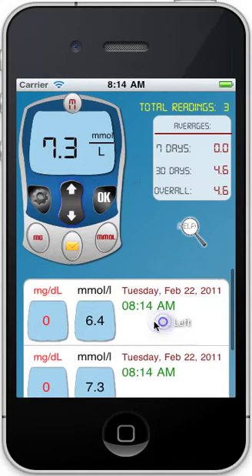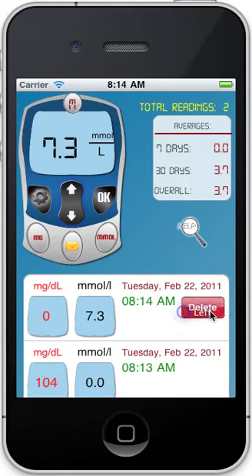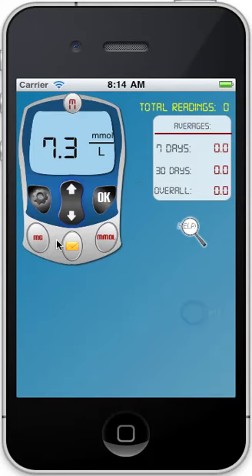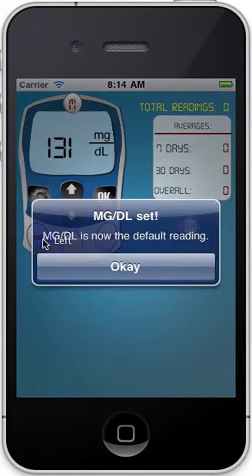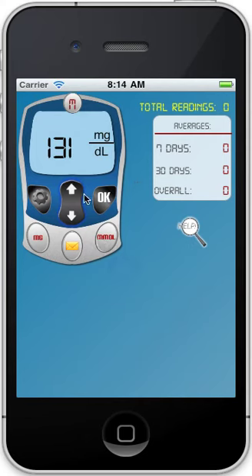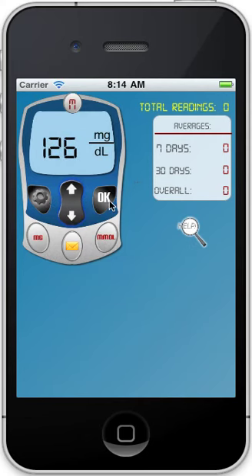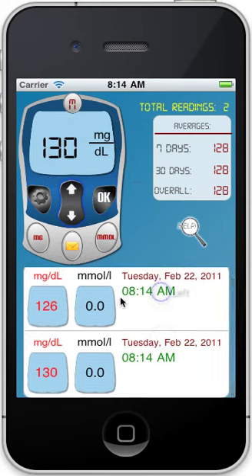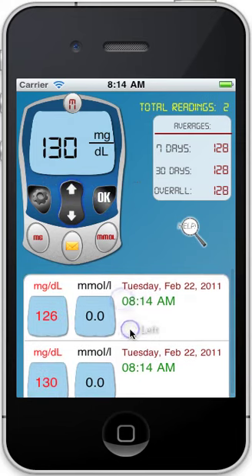I can delete a bunch of these, just to show you. Let's put back milligrams. Now I can just go to 126 and press OK. Next reading is 130 — I'll press OK, and you'll see my readings are right there. Pretty simple, straightforward.